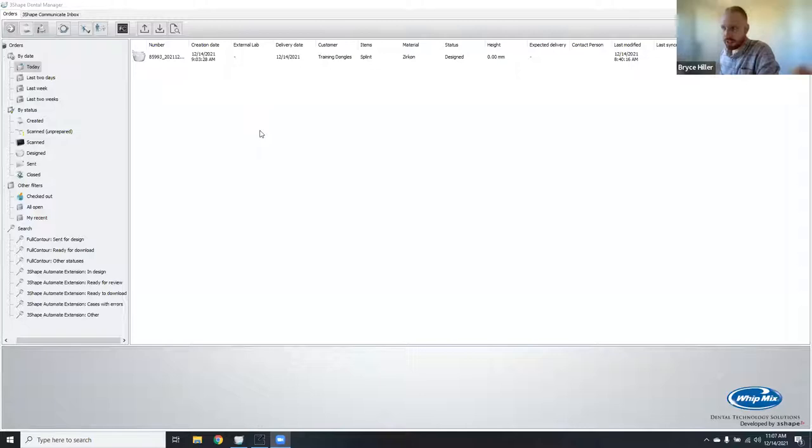Bryce is going to go through bite splint design in 3Shape software — all live demonstrations, no PowerPoint. He's working on two computers: one for his camera and one for his design PC. Everyone should be able to see his 3Shape Dental System software. Splint Studio is actually housed in 3Shape's Trios/Dental Desktop software, but it's easy to link those two together. If they're not already linked, open your control panel, go into system settings, and scroll down to the installation file path for Splint Studio.